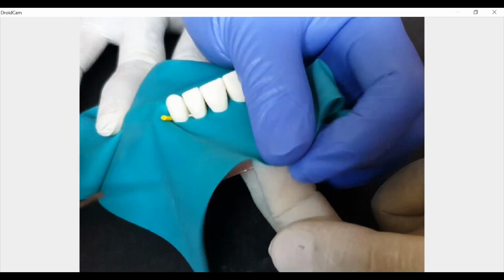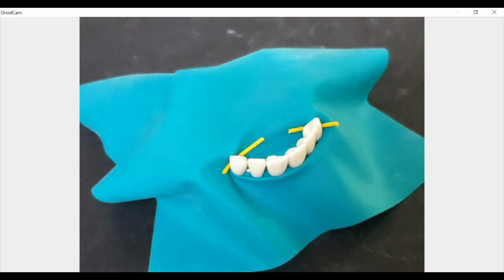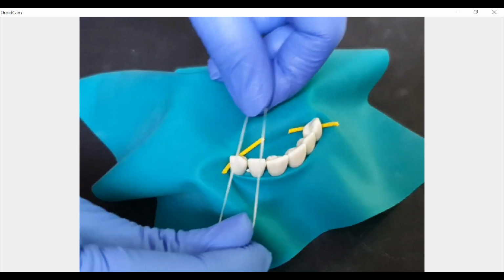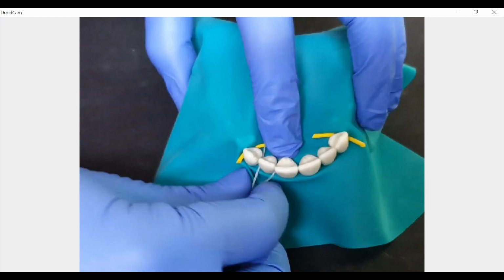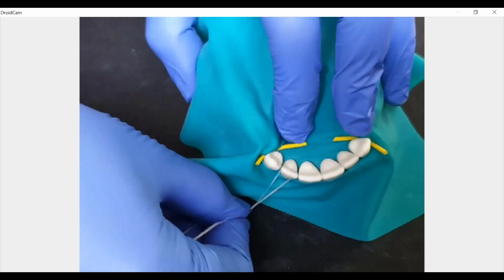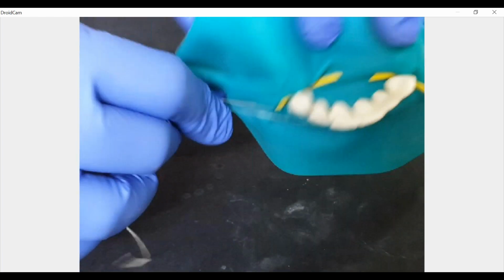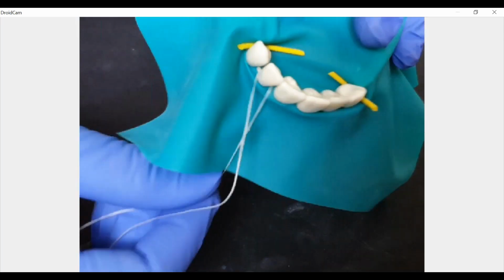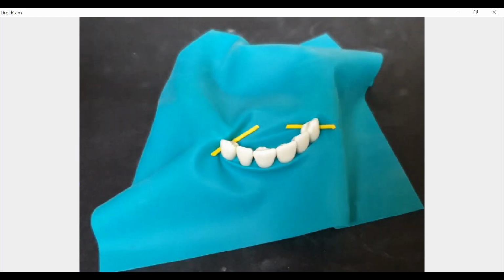But suppose it's a subgingival preparation, then you will need to use the floss. Floss tie ready, where you will use the floss, and watch this. See that? It takes in the rubber dam sheet with it and you complete the inversion. Another way of performing assisted inversion is by using the floss tie. So we will demonstrate how to make the floss tie.